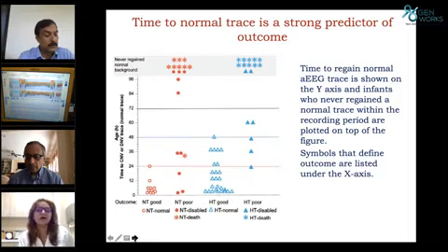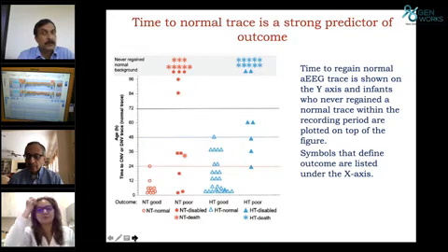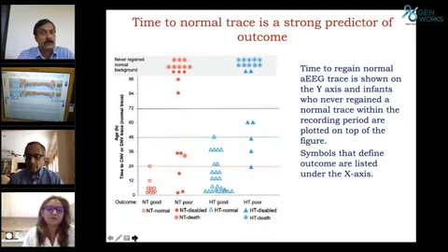But what's happening in the hypothermia group? In the hypothermia group, even with a good outcome, the babies are coming back to the normal tracing even at 48 hours. There was another study which showed 36 hours, but this study showed 48 hours. So we will take it as 48 hours because we want to be more sure before we tell the parents that your baby is going to have a bad prognosis.